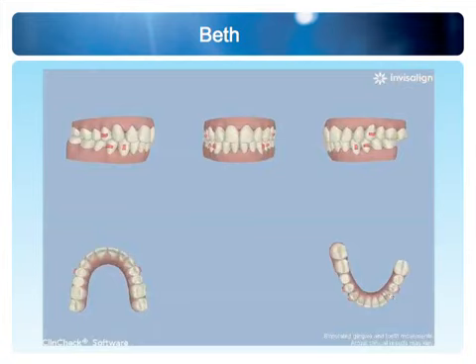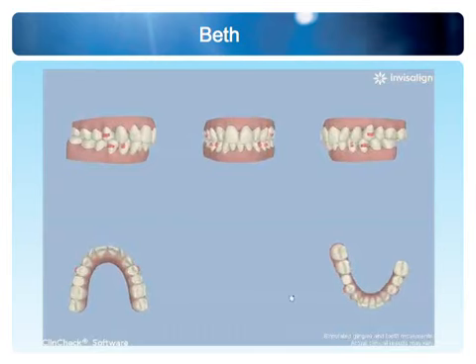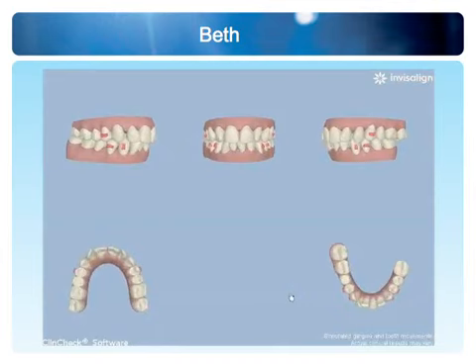Now, in the lower arch, obviously the lower teeth need to be expanded or uprighted, as we call it, to establish proper buccolingual inclination. And doing that gives us room for these teeth. Now, the IPR count in the lower arch was 1.5 millimeters. I did 0.5, 0.5 and 0.5.